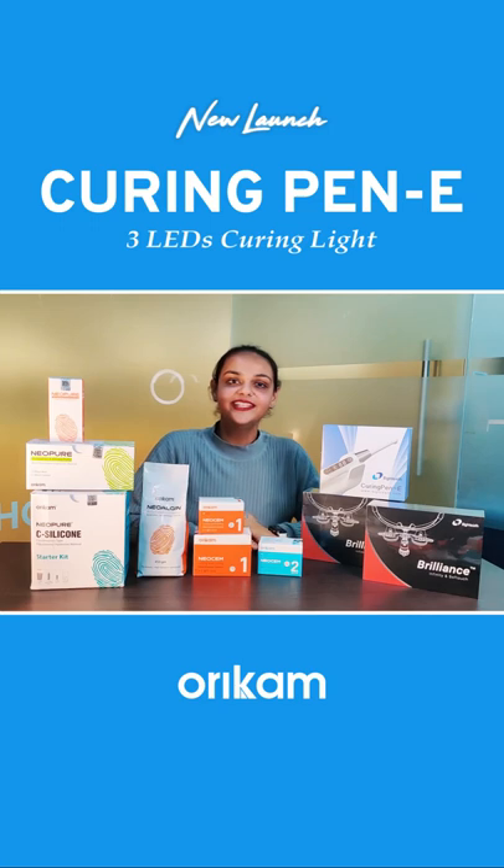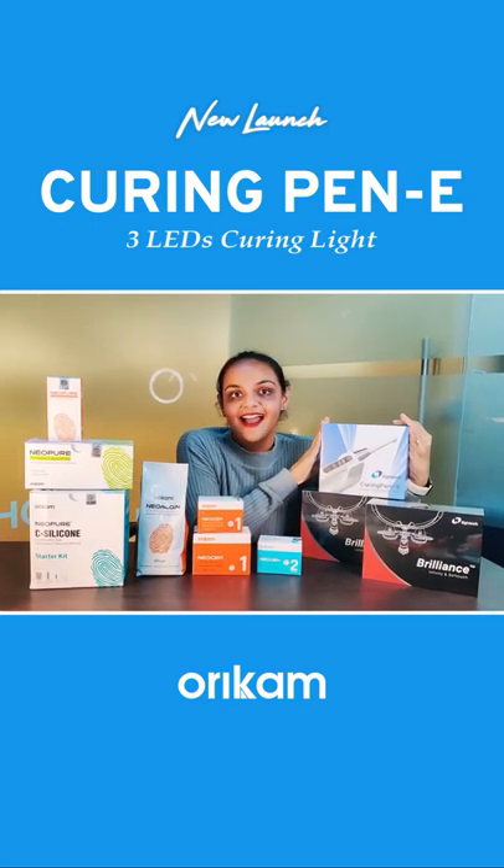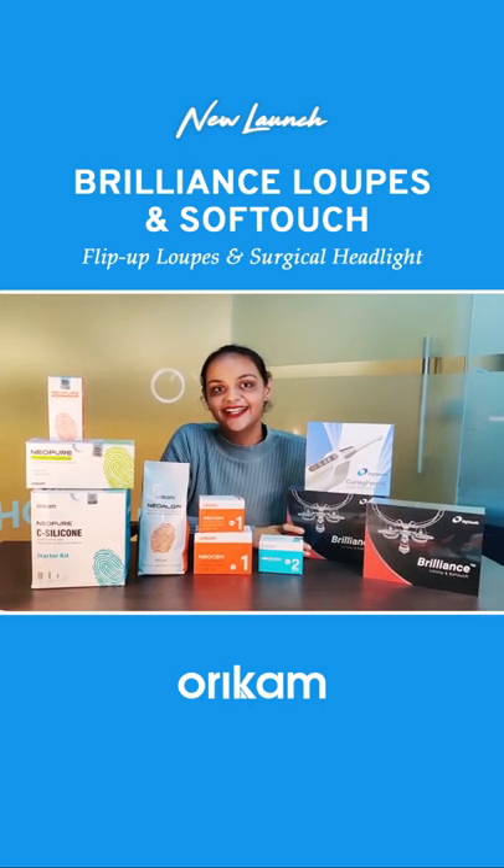And last but not the least, we have also launched Curing Pen E, which is the dental curing light, and Brilliance Flip Up Loupes with its Softouch surgical headlight.